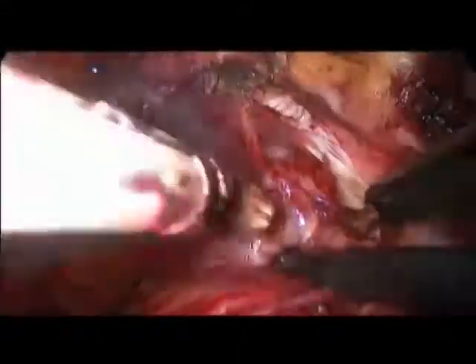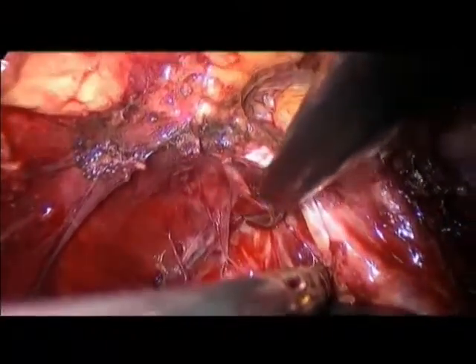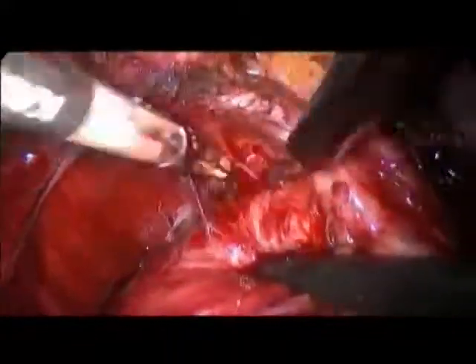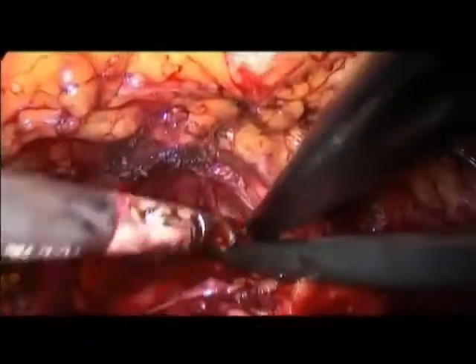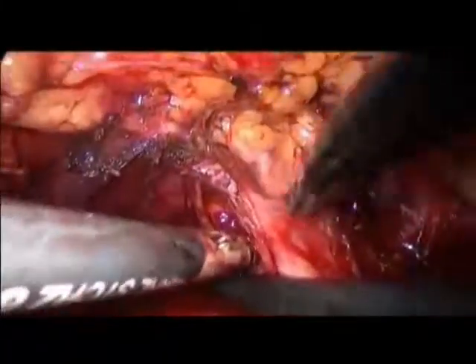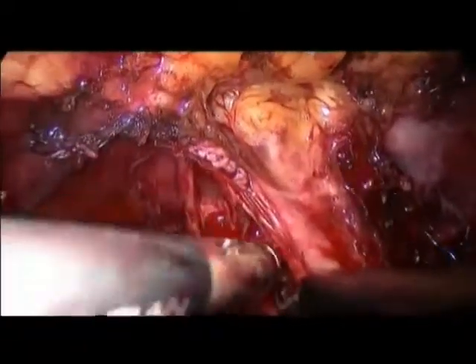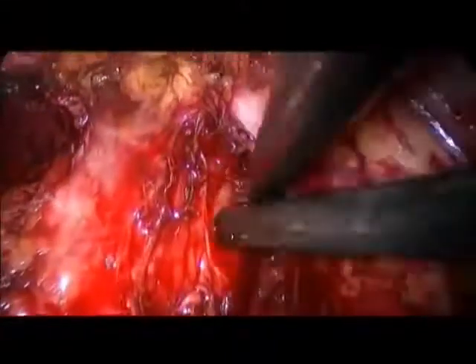So you are not taking this into your stitch? Not yet, because I need to have a better vision of the apical termination first. And you see that, as well as on the other side, it is still covered by the prostatic fascia, the visceral fascia of the prostate. And we might develop this plane here in front of the anterior commissura of the prostate, but this is a blunt dissection, which is rather bloody generally, because it's essentially blunt, so that we prefer to proceed gently on each side.